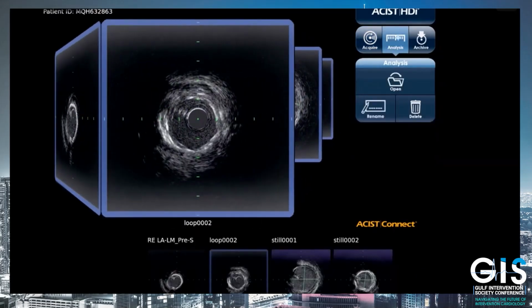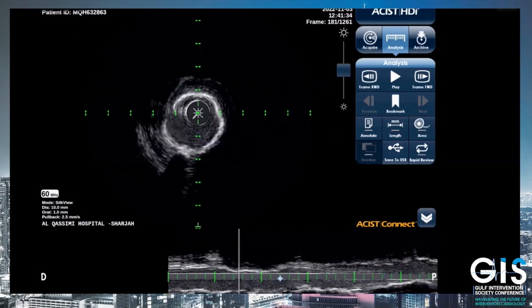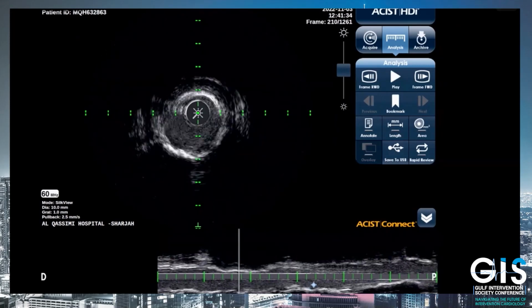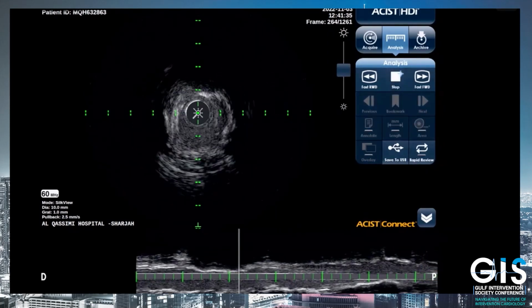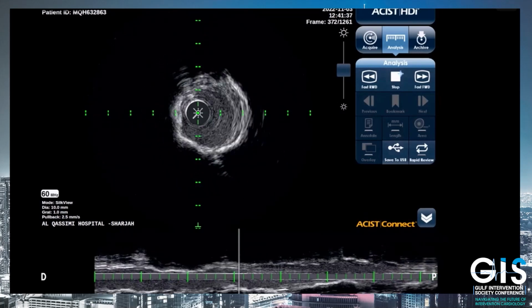So can I have a 22, please? Without a lot of new atherosclerotic changes, the edge and the diameter. 3.5, 22, Frontier, please. So this new stent or delivery device, can we see the run again, Arif? Sure. Can you play again on the big screen, please, the IVUS? So 22, please. 22. And we'll take another 22, 4, please.